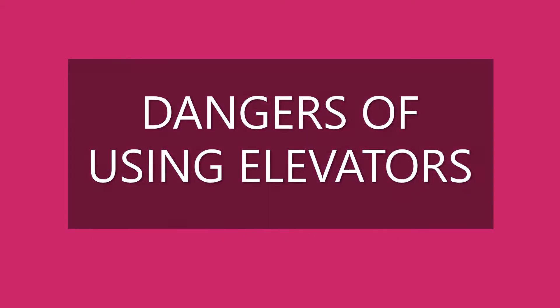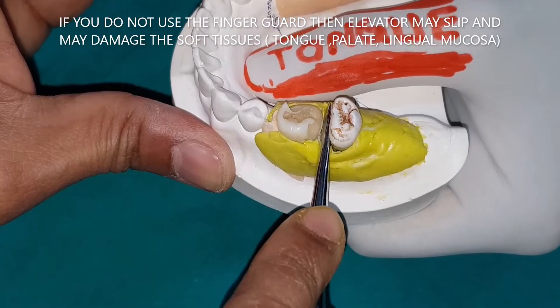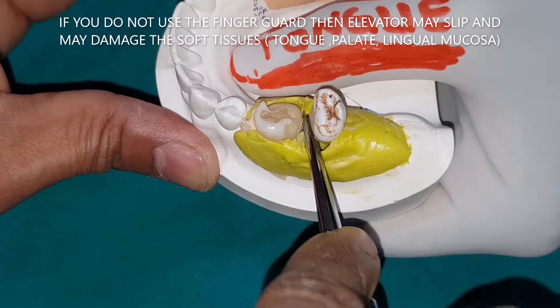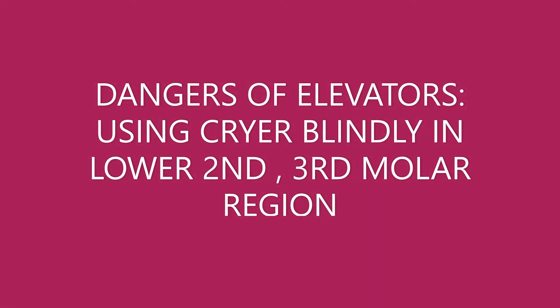Dangers of using elevators: if you don't use the lingual finger guard, your elevator may slip and damage the tongue or the lingual mucosa. Always use a finger guard. Another danger is using the Cryer elevator blindly in the lower second or third molar region.